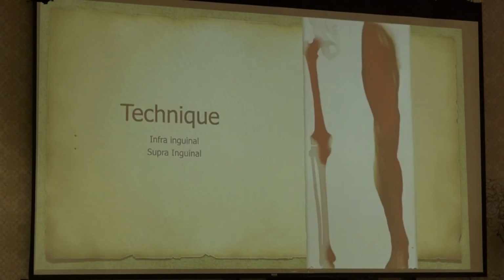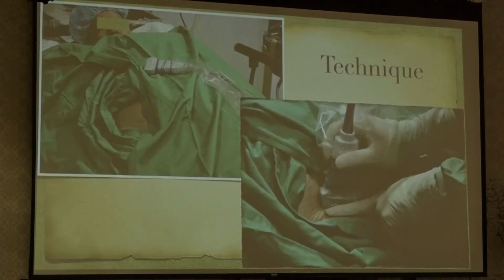There are two techniques, okay? You have infrainguinal or suprainguinal. For this, I am only going to talk about suprainguinal. Okay, so the patient is in the supine position, right?